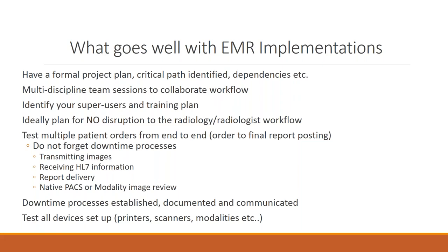Identify your super users and make sure you have a training plan. Who is going to embrace the technology and help the department when the vendor steps away? It's going to be left on your plates, and you need to have someone who is good at technology, is willing and open to it, or is already somewhat of a subject matter expert. Ideally, plan for no disruption to the radiologist workflow. Really step through that. Make sure that anything you're doing that touches the radiologist workflow, whether it be information coming to them, the launching of a PACS image, the dictation, the template, the login, anything at all, make sure that's gone over with a fine-tooth comb.